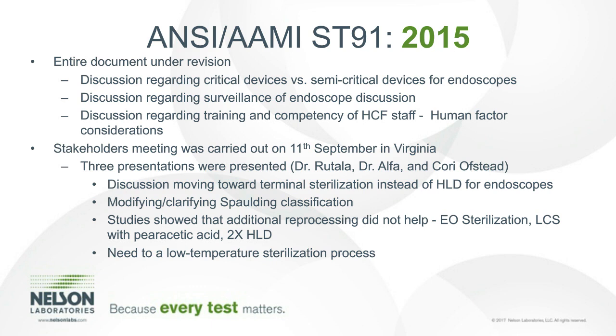So it's still an unanswered question, but we're hoping that in October we should be able to come to a resolution, or come at least close to a resolution to where these devices should be classified. There was also discussion regarding surveillance of endoscopes. Because there's a lot of uncertainty regarding extraction and culturing methods out there, and also the healthcare facilities are not quite ready to do this at this time, this question is also unanswered, and it's still open to the possibility that it may be added or may not be added in the document.